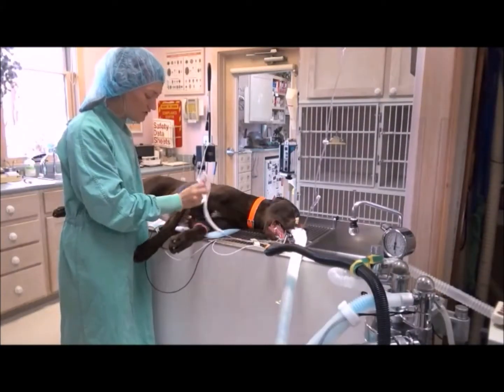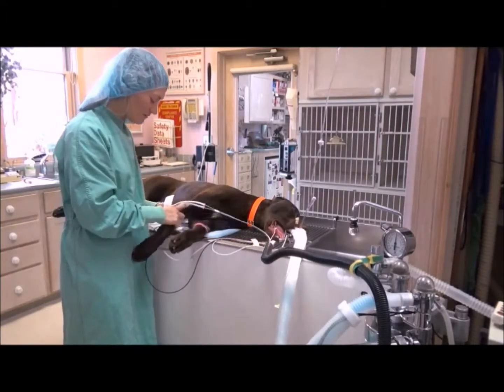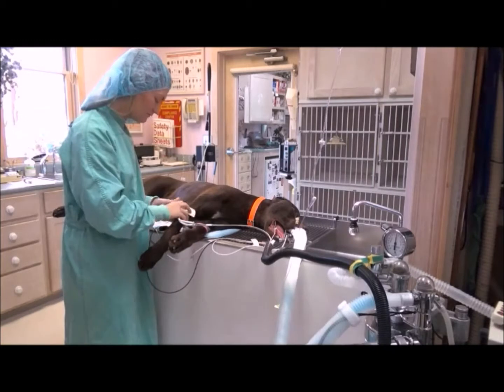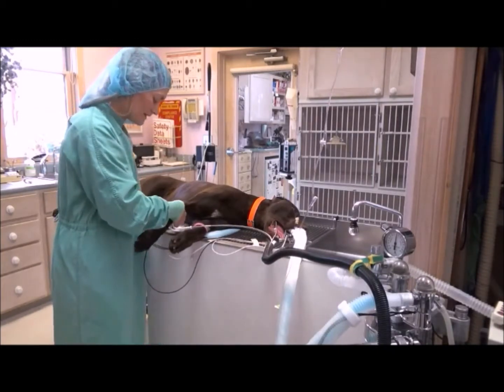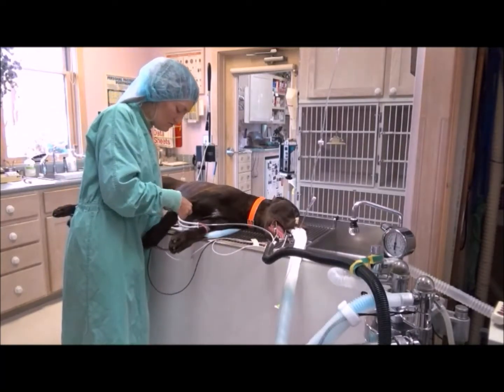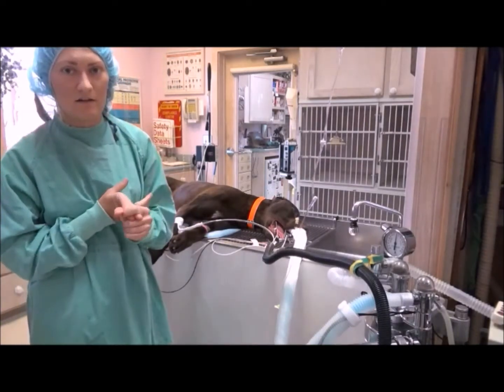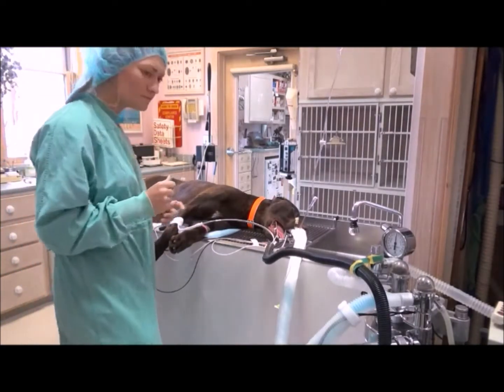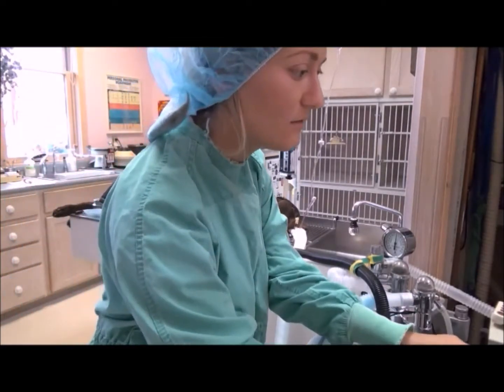To check the blood pressure, you want to apply a blood pressure cuff. You want to make sure it's a properly fitting one for your patient. You can place it on a limb or on the tail. That'll assess their diastolic, systolic, and mean arterial pressure. But you have to inflate and deflate the cuff, so I'll manually do that now.